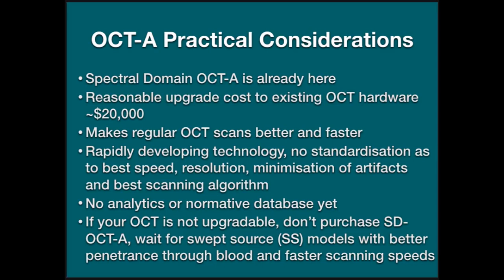And for OCT angiography, and, you know, macular blood and blood from vein occlusions, being able to penetrate through that blood and to be able to see how the capillaries are going, if there's dropout or not, is going to be much better than with spectral domain OCT. So if you haven't got one of these OCTs yet that's capable of being upgraded, I'd say wait and then upgrade your whole unit to one of the new swept source models, hopefully with 400,000 hertz scanning and the full suite of software. But if your OCT is upgradable, the cost is fairly reasonable and it's quite an impressive technology even in its early stages.